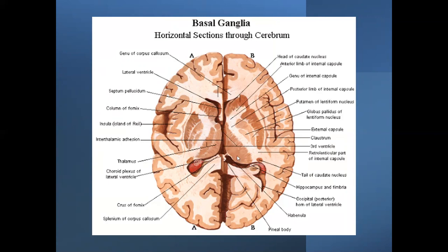To review: the head of the caudate nucleus, thalamus, anterior limb of the internal capsule, genu, posterior limb, putamen, and globus pallidus — these two together form the lentiform nucleus. Lateral to the putamen you can see the external capsule, then the claustrum, and lateral to the claustrum is the insula, known as the fifth lobe of the brain.